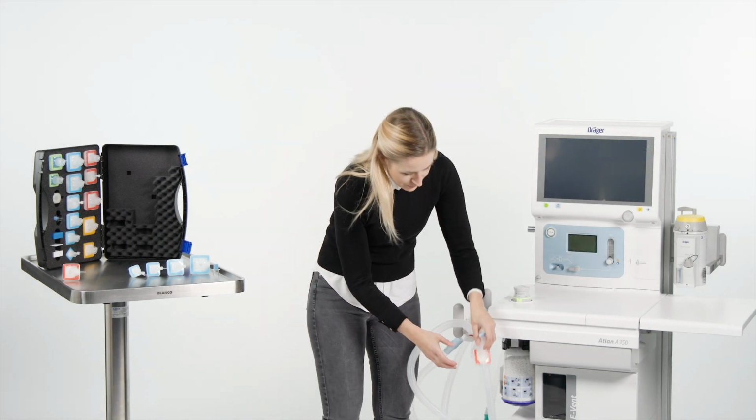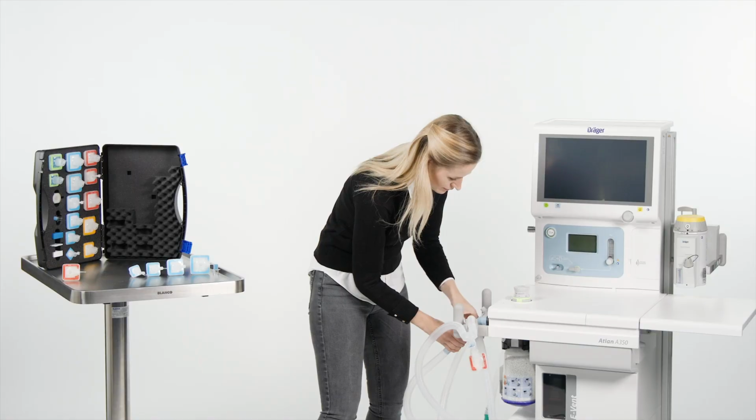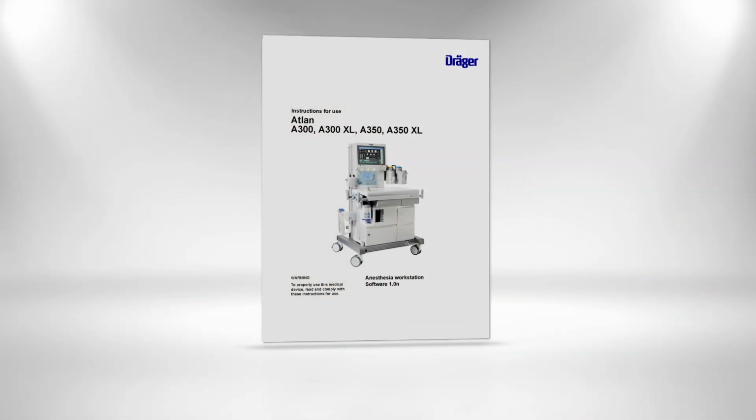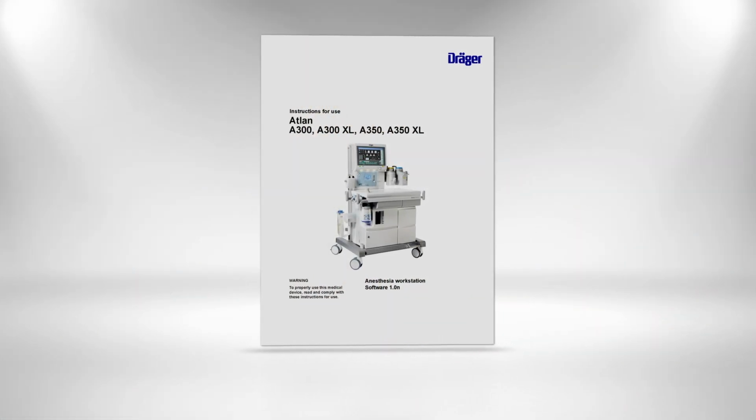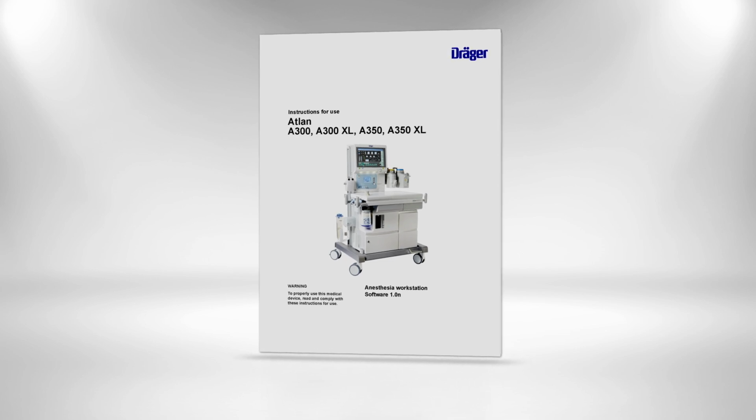After assembly, carefully check that all components are firmly and tightly connected and carry out the device tests described in the instructions for use. The use of filters and HME generally requires special care and supervision by the user.